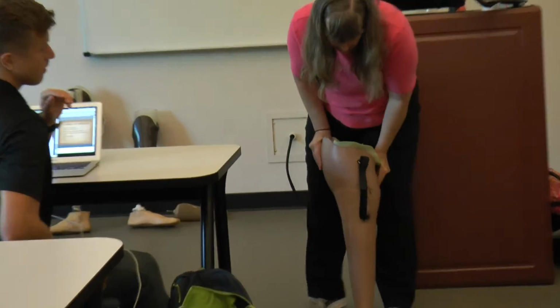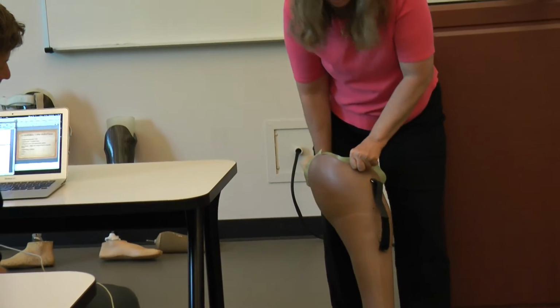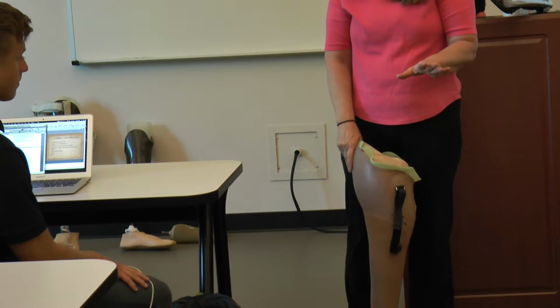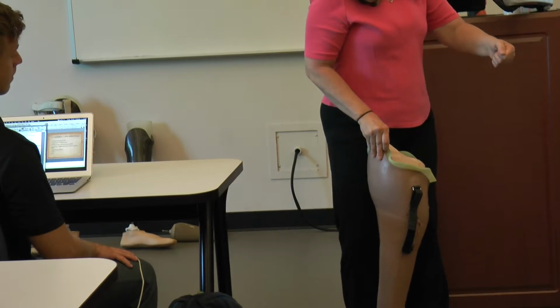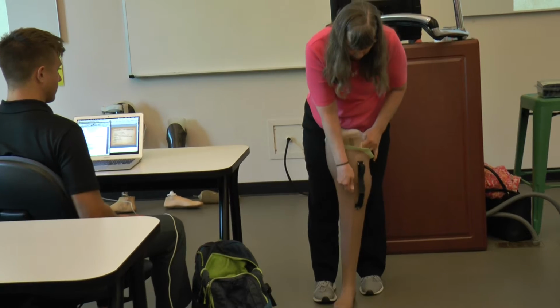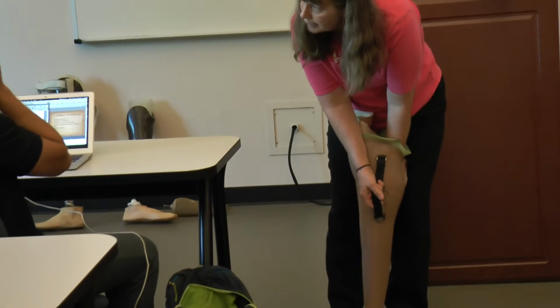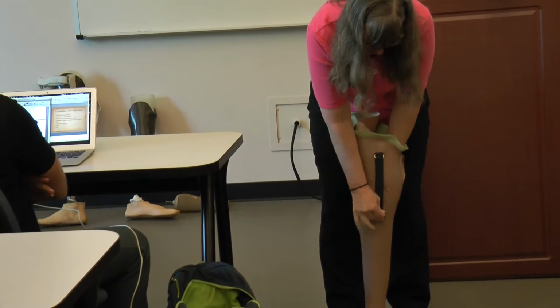All right. When this patient stands up, they're going to extend it, and we'll talk about how to stand up in a minute. But they're going to stand up, and the first thing you have them do is kind of like wiggling into a shoe. Hold on to the walker, put a little weight on it and try to wiggle it into the shoe. At this point, I want to pull the strap out of the hole as much as it will. Now that my limb is seated down in it, I should have some slack in the strap. So I pull it out and tighten it up as much as it will.